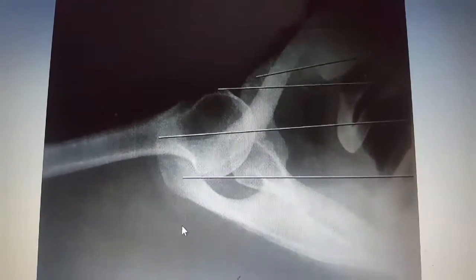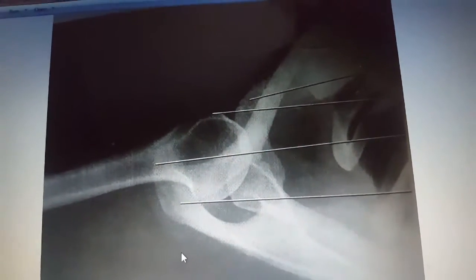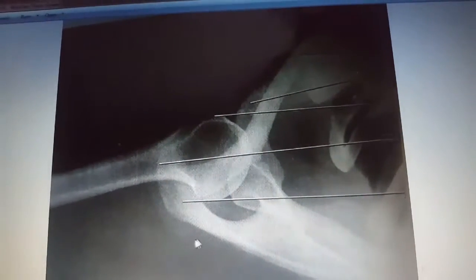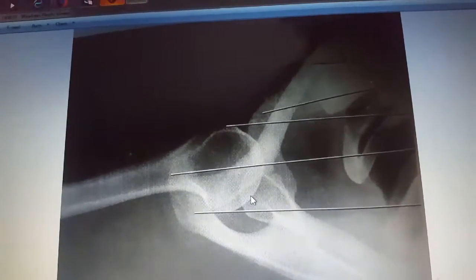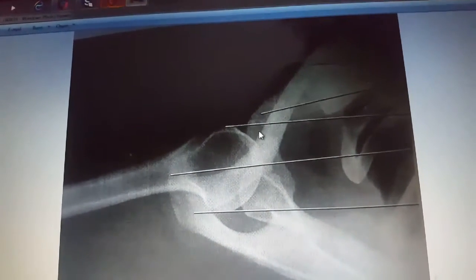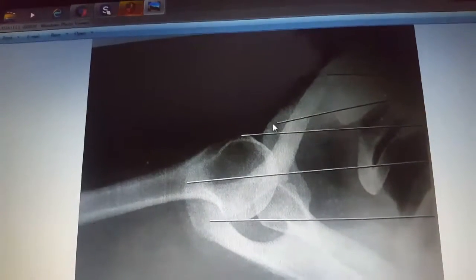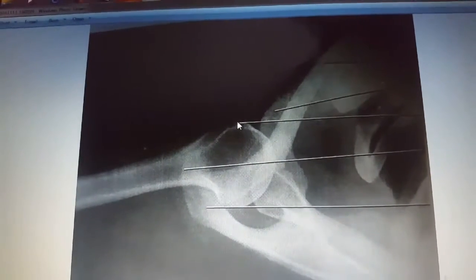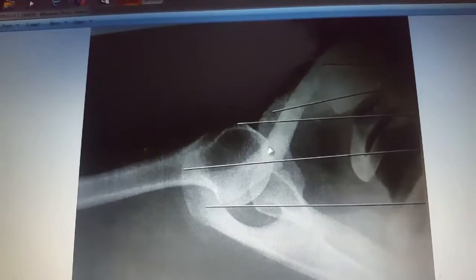The evaluation criteria for the last projection of the shoulder, which was the superior inferior axial projection, is checking for evidence of proper collimation. Also, the scapulohumeral joint, which we could see here. And the coracoid process projected above the clavicle, which you could see here. As well as the lesser tubercle in profile, which is there. And the AC joint through the humeral head, which we could see here. The AC joint coming down through the humeral head.